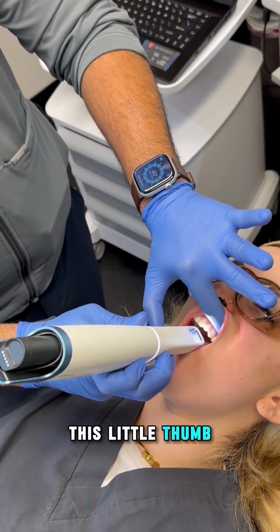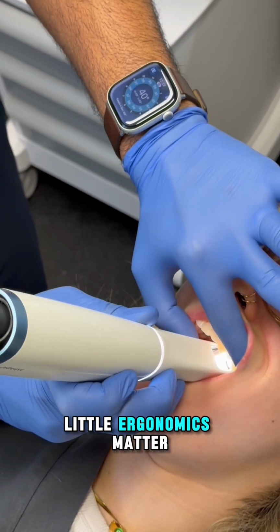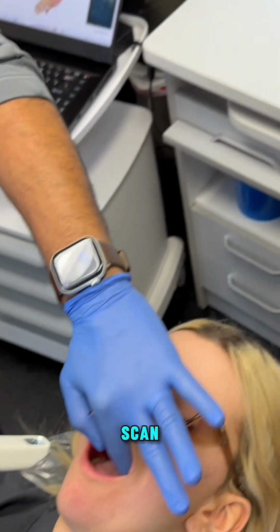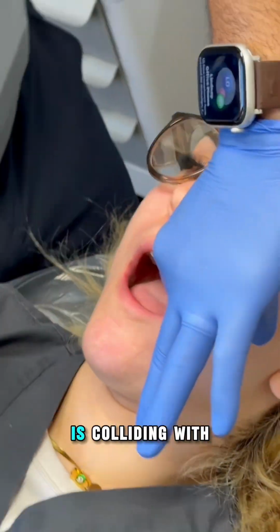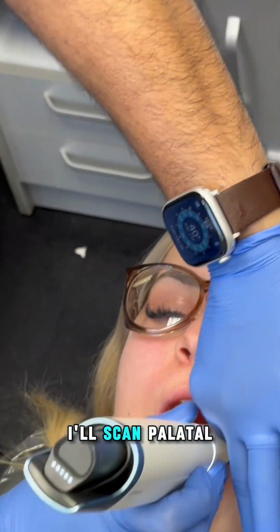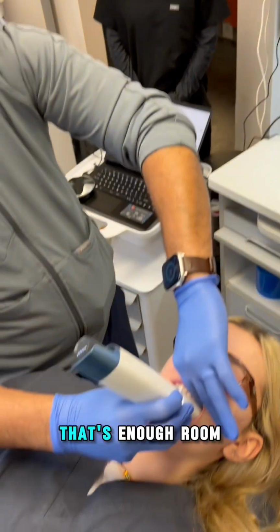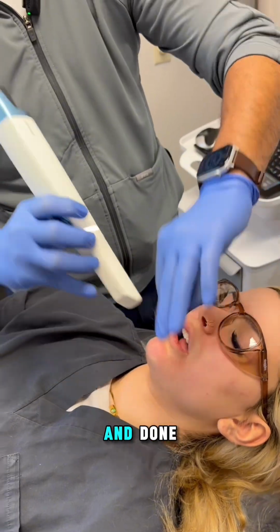This little thumb is guiding my scanner. Little ergonomics matter. So this allows me to constantly look at the position where my scanner is scanning. I got a good buccal lingual scan. Same thing, open wide. So now this side of the mandible is colliding with the second molar. So when I go back, I'll scan palatal and I'll tell the patient, relax. So I can feel that they are now relaxing. That's enough room for my scanner to go back. And I'm coming back and done.